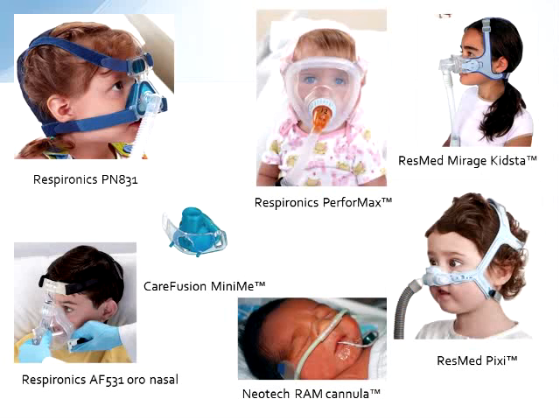So one of the neat things about that, that's a Neotech product, is they're actually working currently to develop a pediatric-sized cannula, to extend the use of that device even further in the PICU. And I'm certainly looking forward to that, because the one thing about that device, and you guys can probably see this, is it doesn't have a headgear. So it takes away that second component. I mentioned that you had to find an interface that fit them, but also a headgear. Well, you still have to ensure that this cannula fits the child. It doesn't work for every single child, but the nice thing about it is you take away the does-the-headgear-fit piece, because there is no headgear.